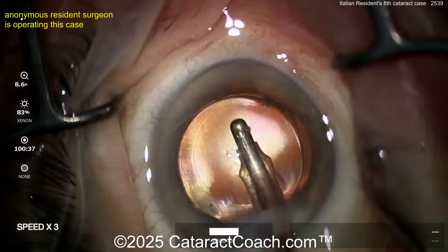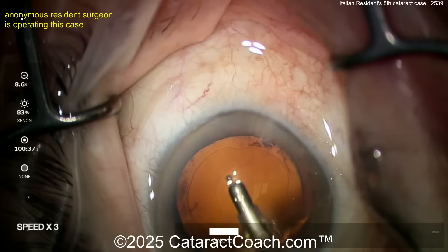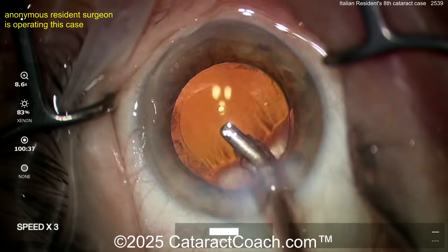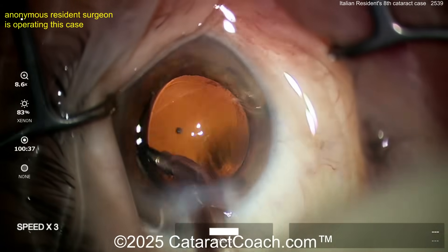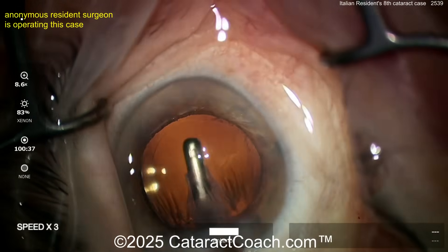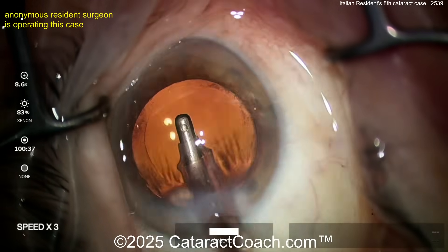If you go behind the optic and remove viscoelastic, I'm going to be blown away — because for case eight, you probably shouldn't be doing that, but let's see. Cleaning up the viscoelastic. This cohesive viscoelastic comes out pretty easily — you can just tilt the lens. There's a little bit of cortex there. Is that cortex you grabbed in the bag? Couldn't quite tell.